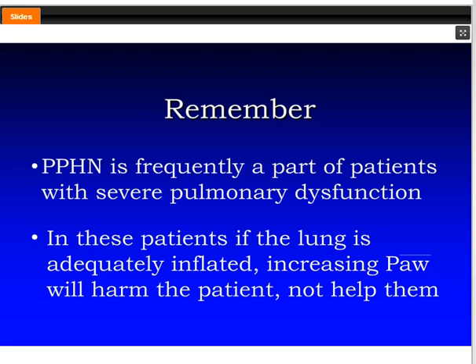If you have a patient who has a somewhat lower lung volume, then you're actually better off leaving the ventilator on when you suction the patient. But one of the keys is to remember that suctioning can de-recruit the patient.